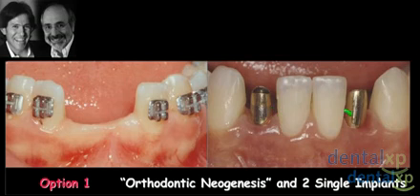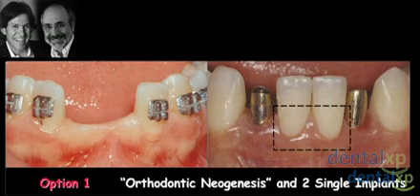and then 2 single implants placed in the area of the laterals, avoiding this very, very difficult situation of placing 2 implants next to one another in the small diameter areas. So just one option, again, to move the laterals to the midline, creating what we now have as 2 single implants as opposed to 2 multiple adjacent implants that are really, again, fraught with problems for us as implantologists. And focusing in this area, really creating this and recreating this deficiency non-surgically using orthodontic means.